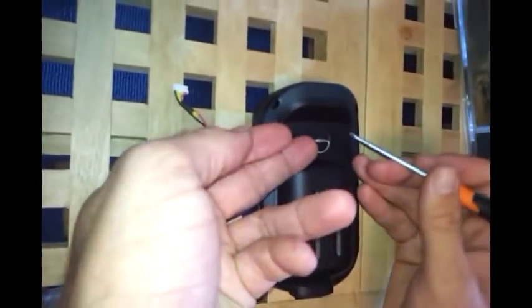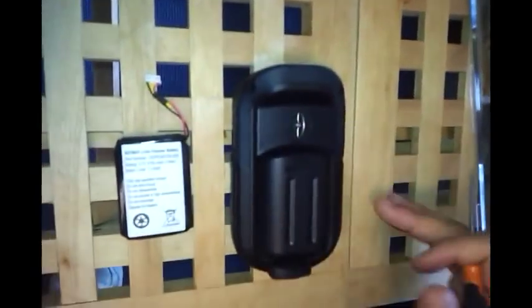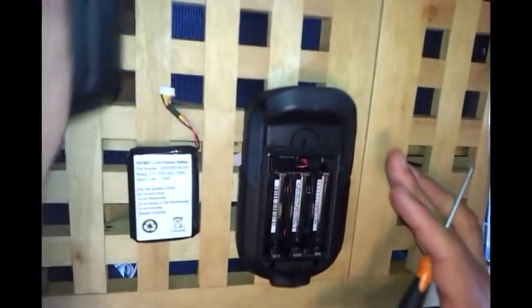To do this, the first thing you need to do is remove the D-ring by lifting it up, turning it so it's vertical, and pulling away the back cover.